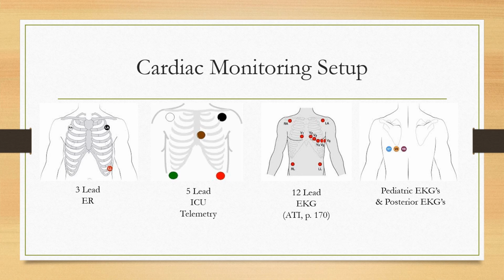For example, we can see the bottom part of the heart. We can see the left side of the heart, the right side of the heart, the back side of the heart. So why are we doing an ECG? Well, we're looking at the rhythm, and we're doing an ECG with someone who comes in with chest pain. We're looking for ischemia or infarction.